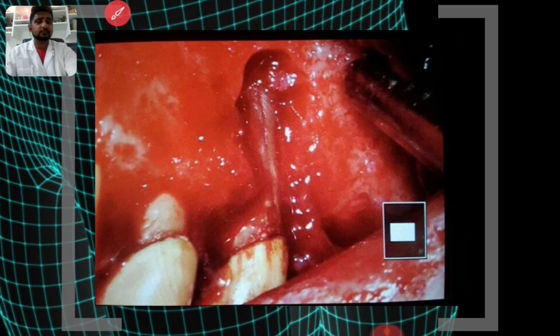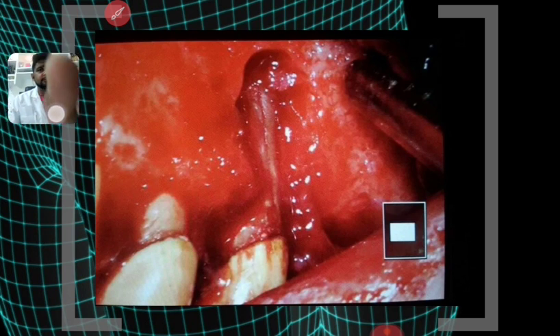We just removed the root, extracted the root, chopped the bridge, cleaned the bridge, made it a hygienic pontic, and filled the underside of the bridge with composite and finished it nicely. So that's how we dealt with this case.